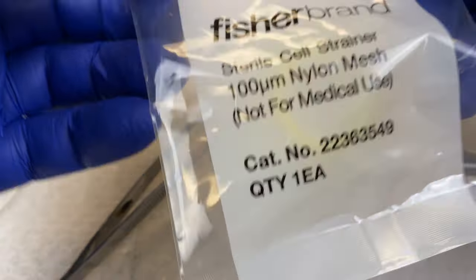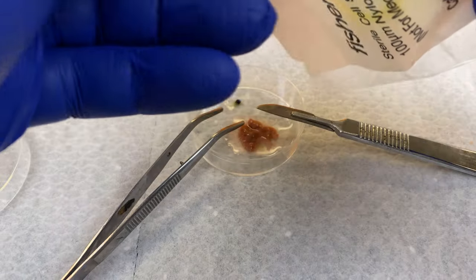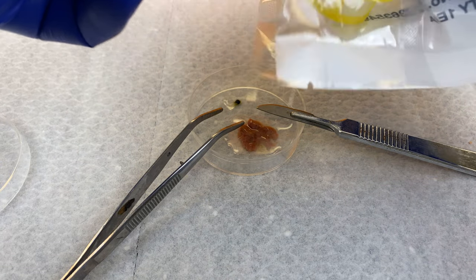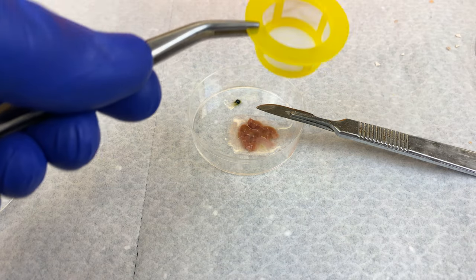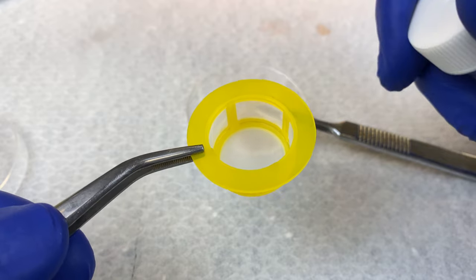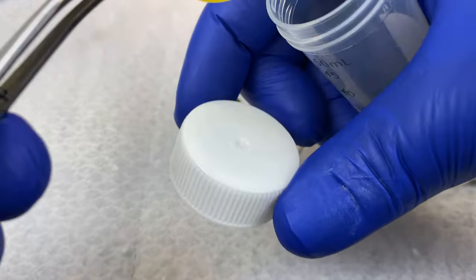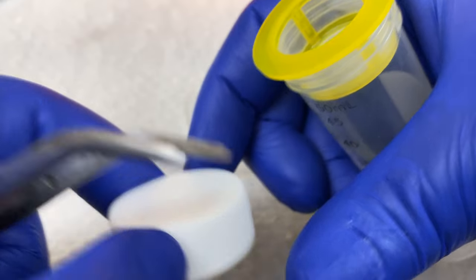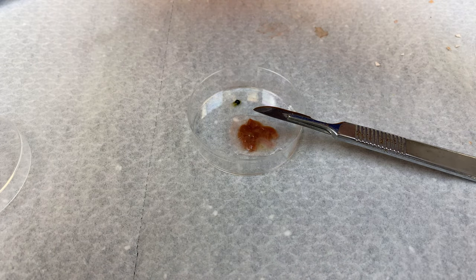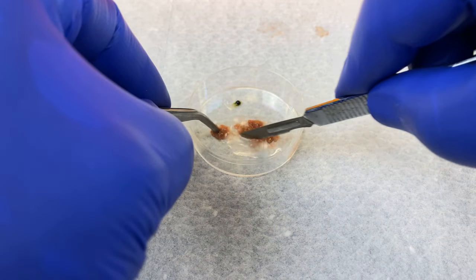Let's open it up. Look for the tear point — there it is right there. Tear it open. We can pull this out with our sterile forceps and place it into the lid of our 50-mil conical tube. Place it inside, and then place the cap on top. This will not screw down — it will just rest on the top, preventing any contaminants from being blown into our tube.